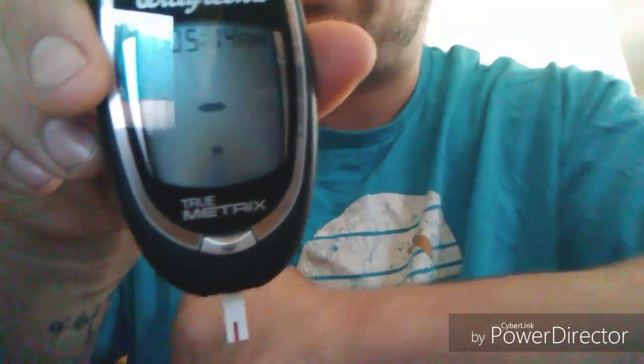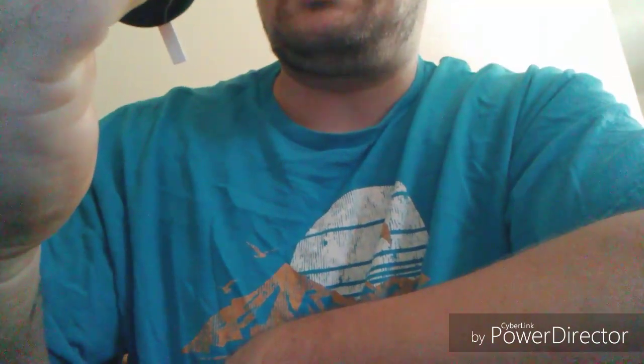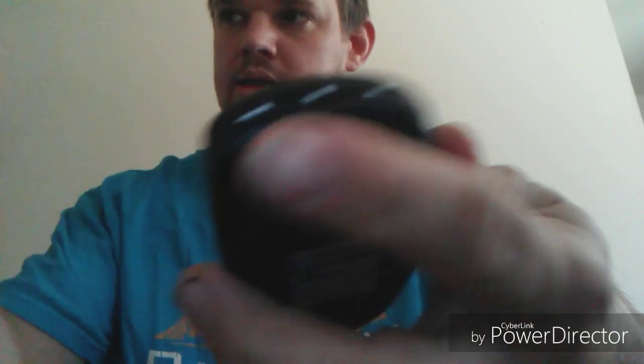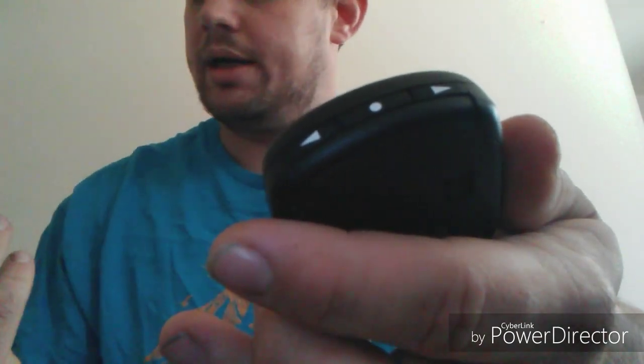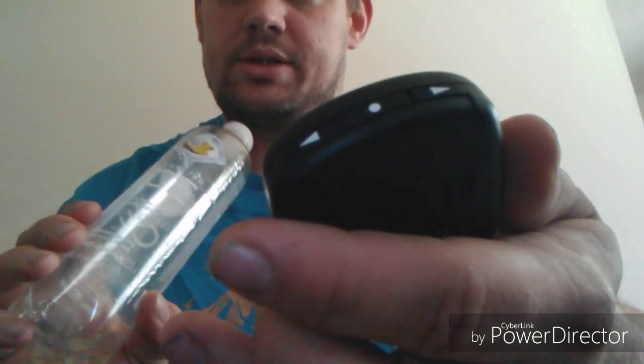There we go. 98. So if anything, I went down some. So yeah, this drink does not increase your glucose, which means it probably doesn't increase your insulin either.